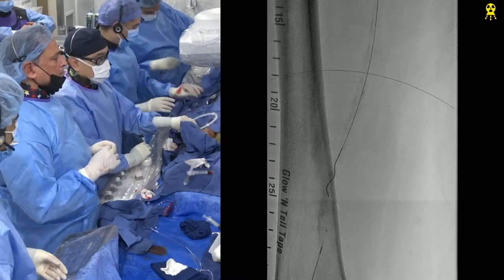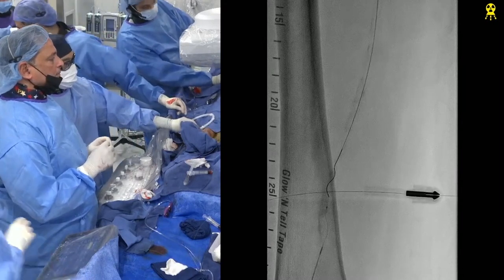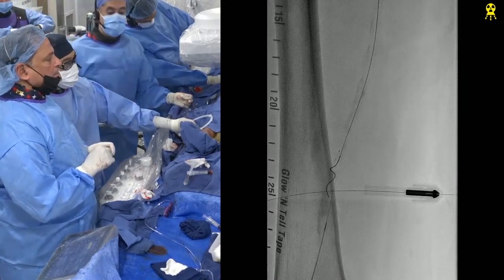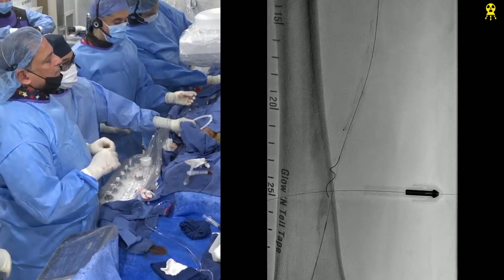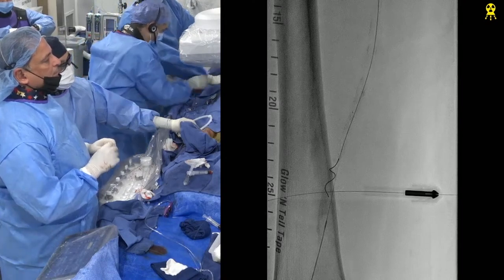Now I'm going to give you... So, you want to open it? Yeah, take the CoreCross. Yeah, when Navicross, open it. Open track, right? Yeah, 035. Can you get an 018? Yeah, when over. Looks like I'm in. Hold on. Yeah, PK has one. We need the other one. I got it. Don't worry about it. Same problem.